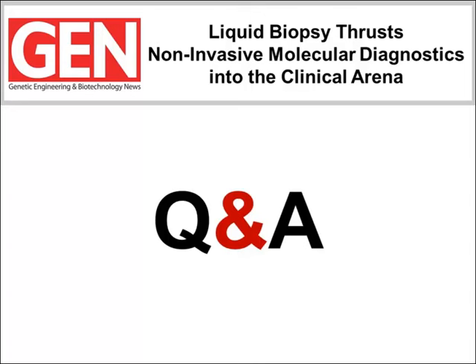That's a great question, and I can almost hear their pain on the other end of that question box. Indeed, I think the question gets to the heart of the matter for separating out the two philosophies here. If you think about how I presented our pipeline, we have a tumor acquisition stage at the time of initial surgery or at the time of recurrence, where we access the tumor, sequence it, and look for mutations. We do that for exactly the reason in the question: there really aren't many recurrent mutations in ovarian cancer other than P53 mutations, and there are no true hotspots that would cover every patient. You've really got to dig in and personalize this test the way we're doing it now.